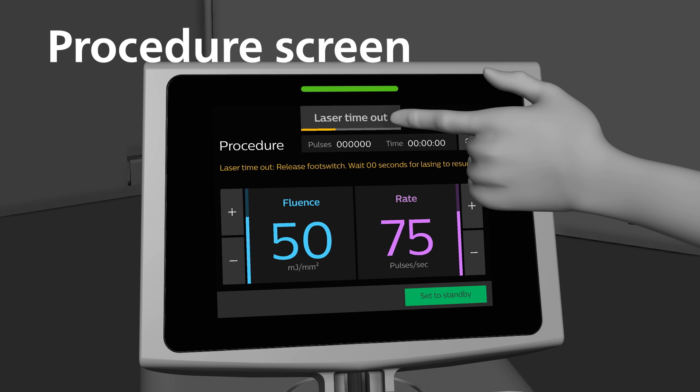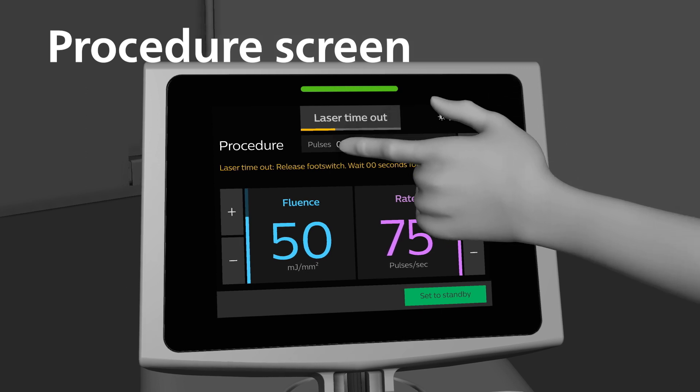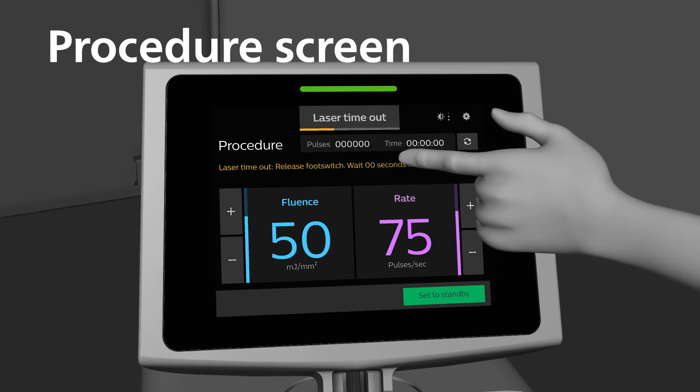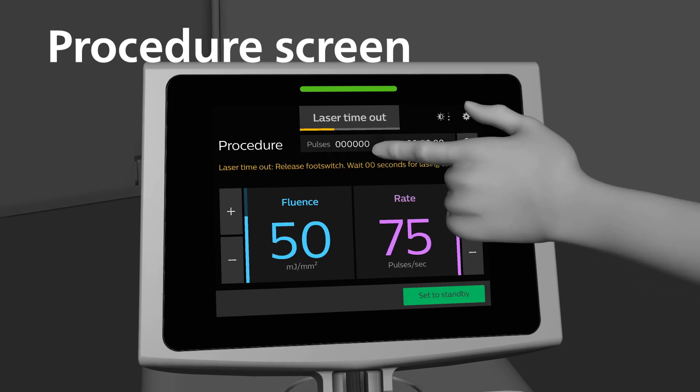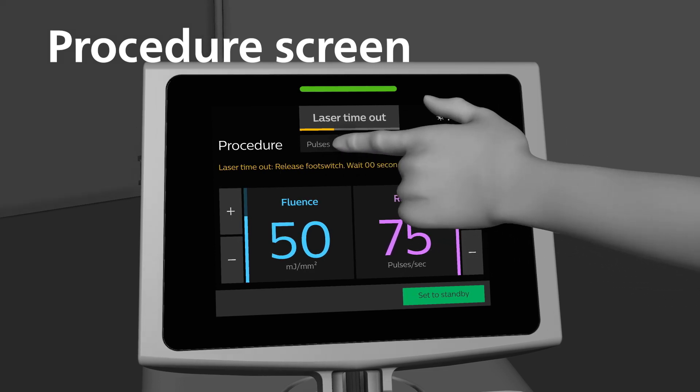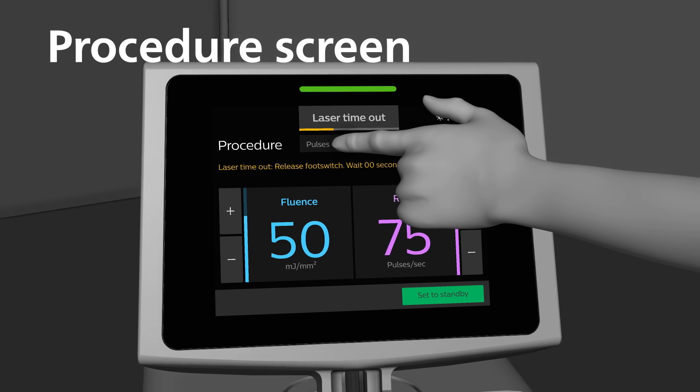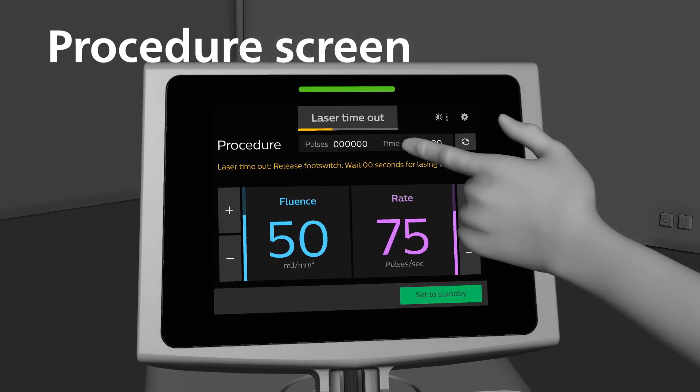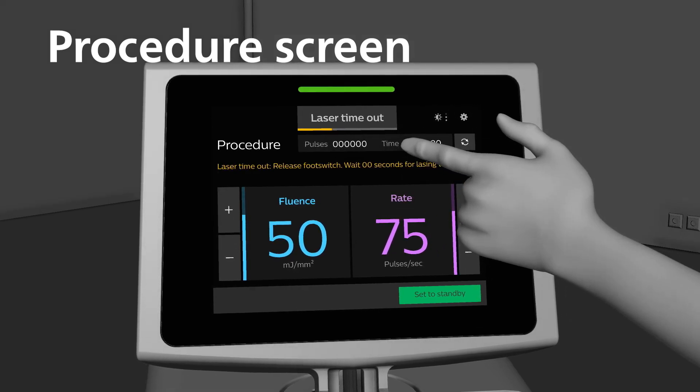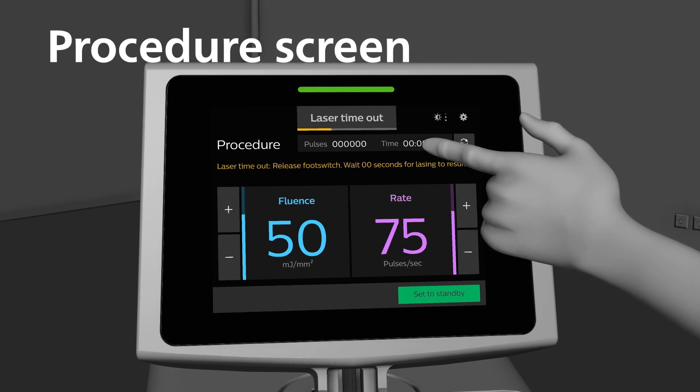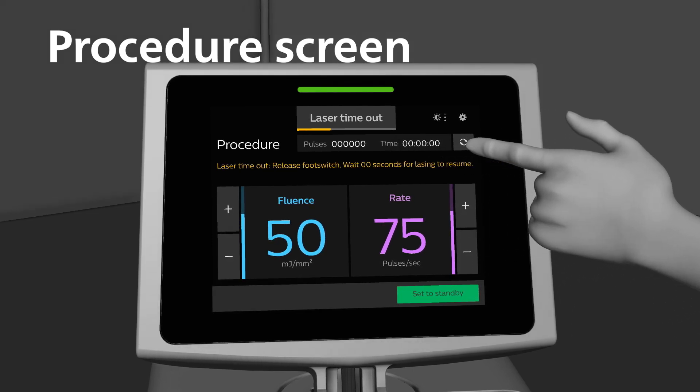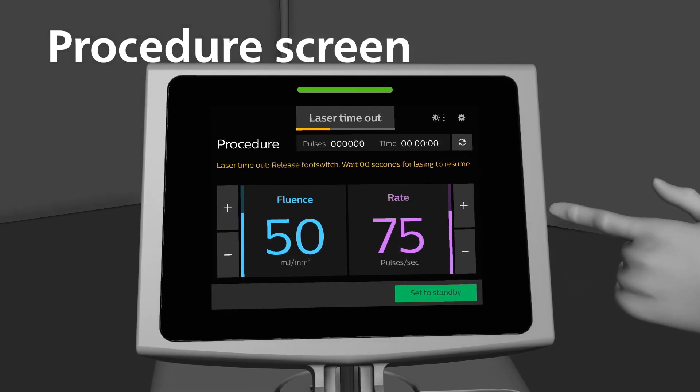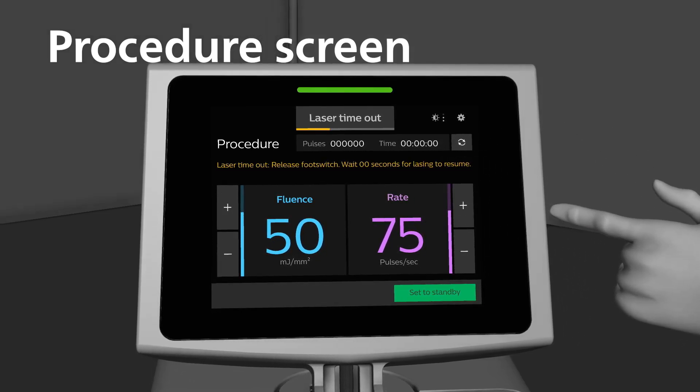On the touch screen, you have a running total for pulse and time. The pulse display shows the total number of pulses during a procedure. The time display indicates the total lazing time of the procedure. There is also a reset button to reset the pulse and time displays.